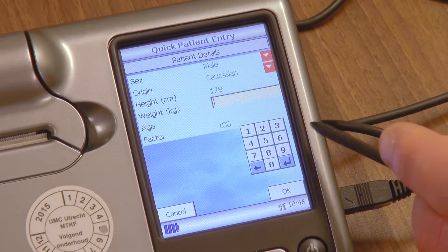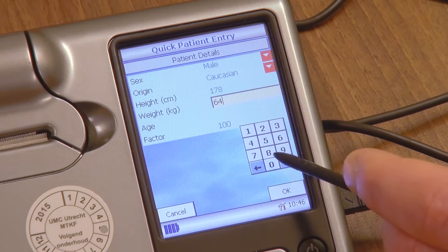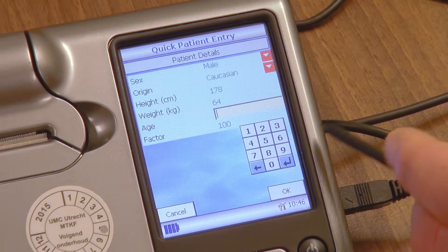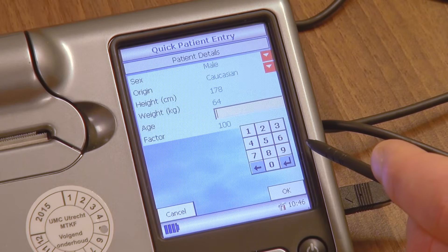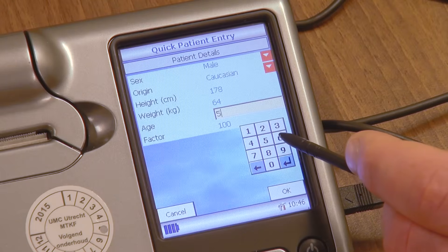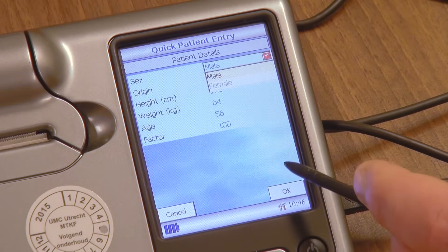Report the patient's weight by filling in the weight. Units are country specific. Report the patient's age by filling in the age in years. When you are complete, press OK.